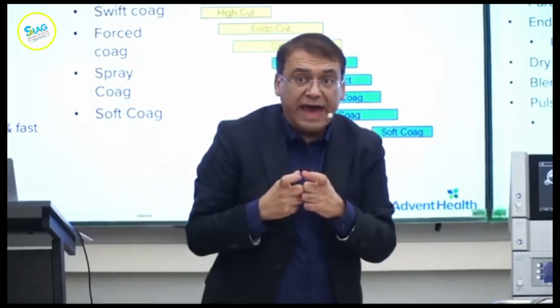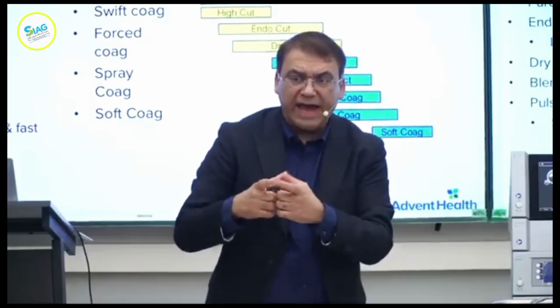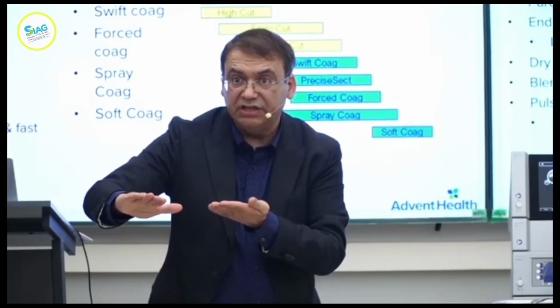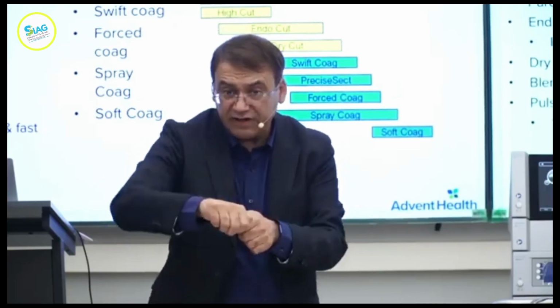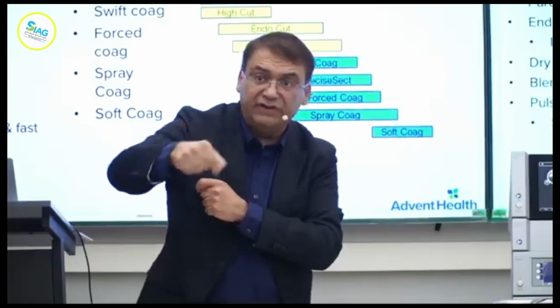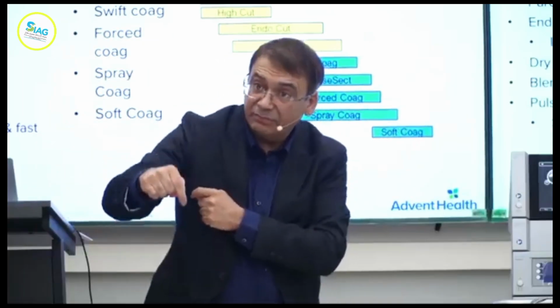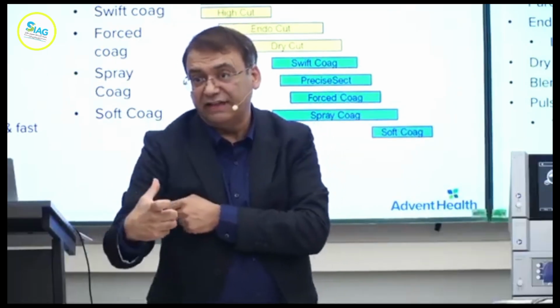So for the grounding pad, now there are smarter pads, but if you still have the older pad, you have to make sure it's completely touching the surface and covering a lot of area. Because if it comes off and only a part of it is touching the skin, then it's going to cause a burn, and that's the same concept as the snare. So that's the density.